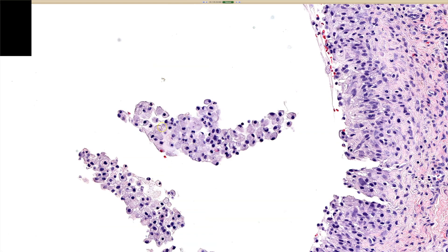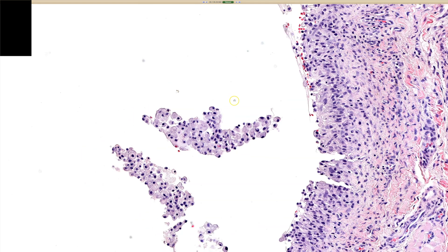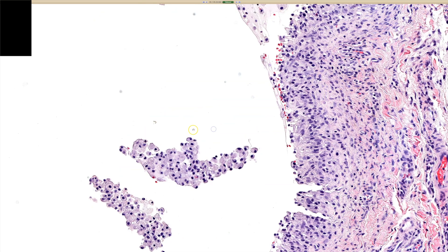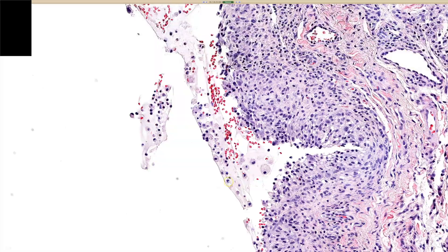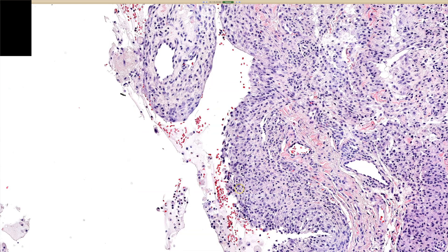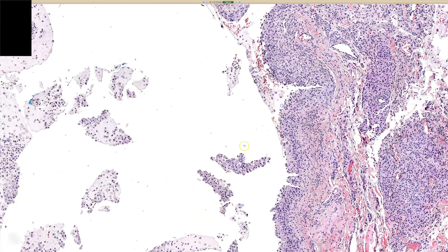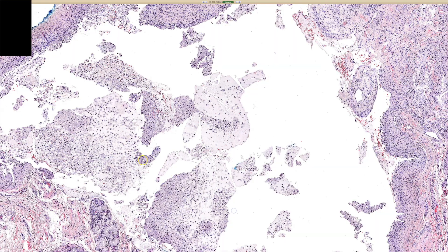The wall is lined by a layer of palisaded, frothy, foamy mucin-filled histiocytes — muciphages, if you will. They look like they're lipid-filled but are mostly filled with mucin material. They look very similar to xanthoma cells, maybe a little more blue, and there are free-floating ones in the middle as well.